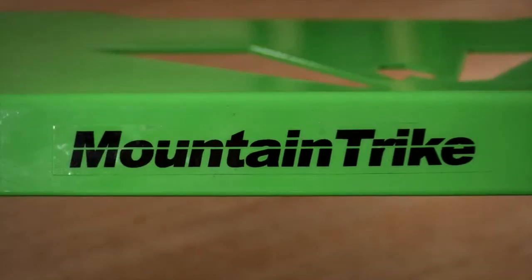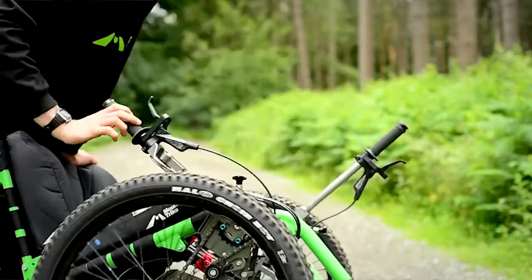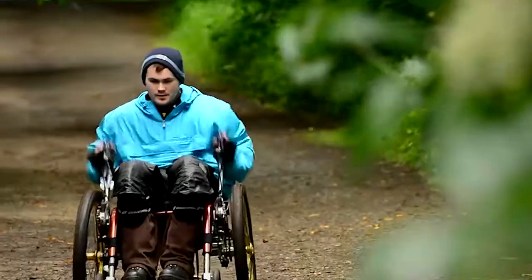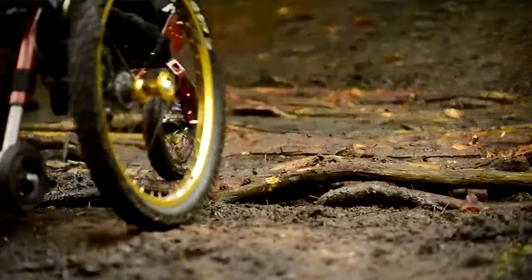All of the controls are operated by your hands from these levers, and it's a much more efficient position to push in. That enables riders to go up and down steep hills and experience far greater independence to enjoy the countryside.